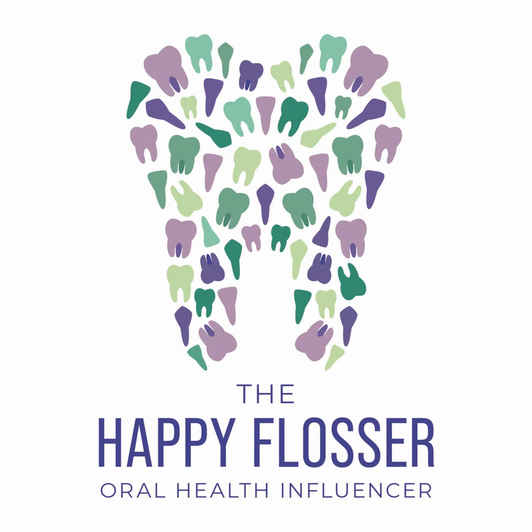And then with the peri-implant bone loss, the bone loss on an implant is a major sign of peri-implantitis, and the radiograph will help reveal the bone that is remaining around that implant, not necessarily bone lost, right? Because we want to know that our starting point. So the bone loss percentage needs to be estimated based on where it is expected to be for that implant.